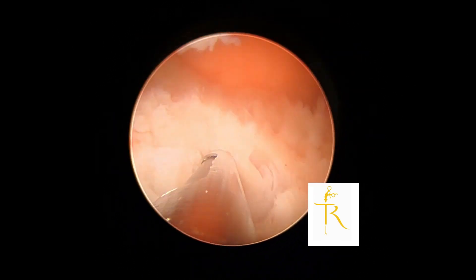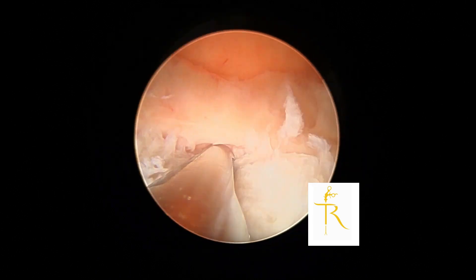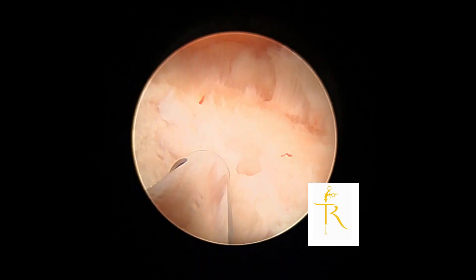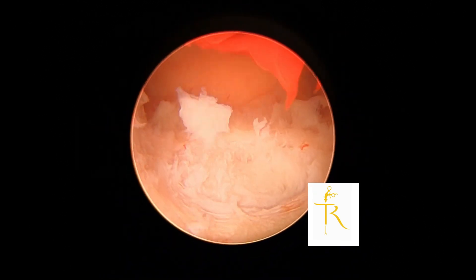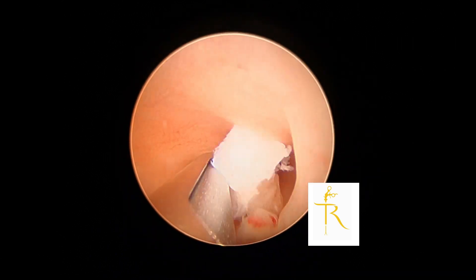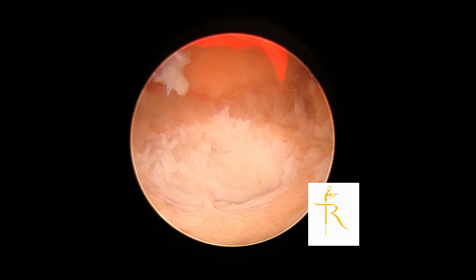Usually with a type 2 fibroid it's a bit difficult to get the entire fibroid out, so what we do is level it out to the surface of the endometrium. We are doing this for a case of abnormal uterine bleeding in a perimenopausal woman. With the mechanical morcellator I am comfortable to go into the muscle of the uterus where the fibroid is located.